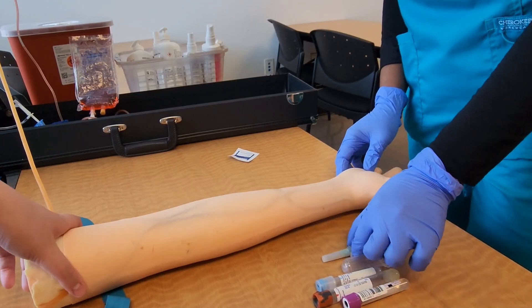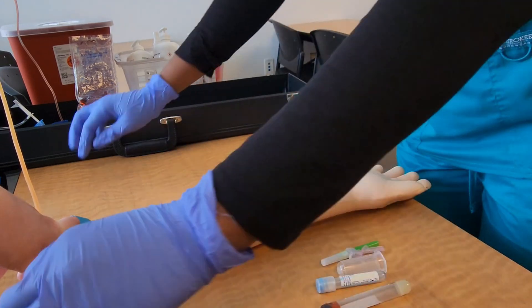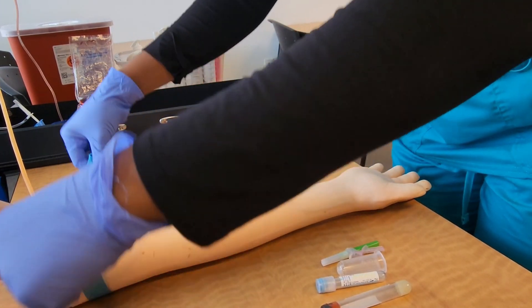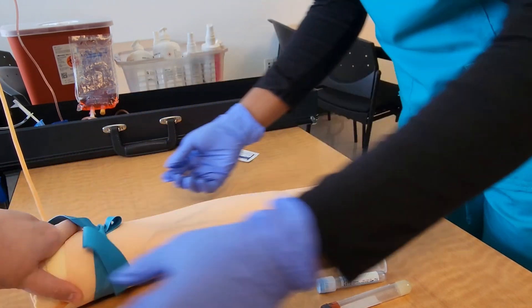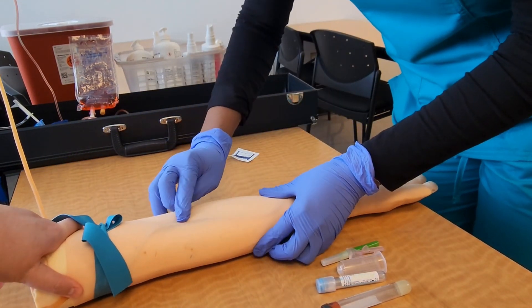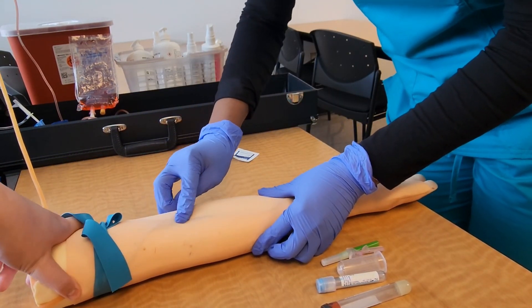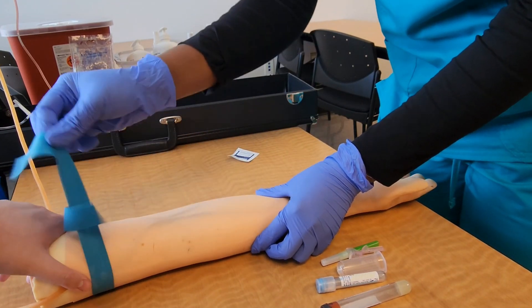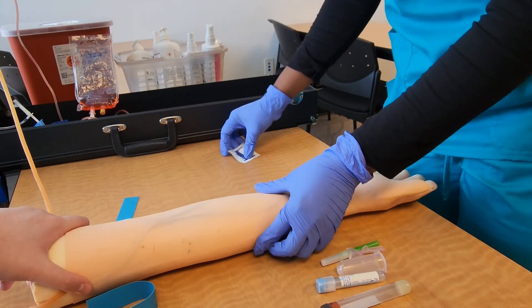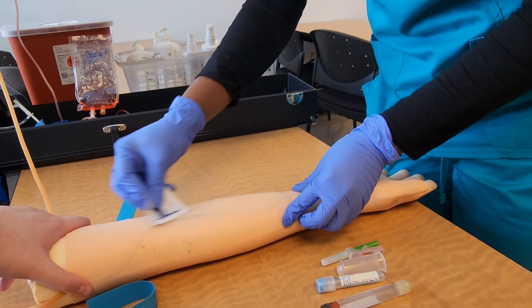After obtaining all that information, we're ready to perform the phlebotomy procedure. I'm letting the patient know I'm about to tie the tourniquet and I'll ask them to let me know if it's too tight. Remember, you don't want to leave the tourniquet on longer than one minute. I'll go ahead and palpate for a vein to find it and assess its size, depth, and direction, then use an alcohol pad to cleanse the site.